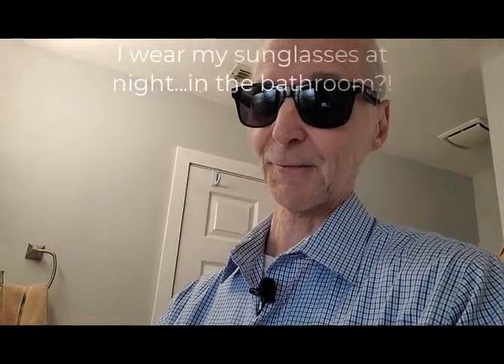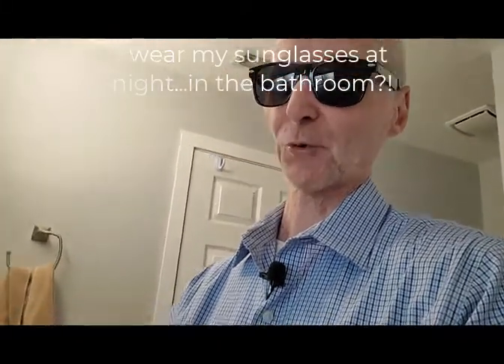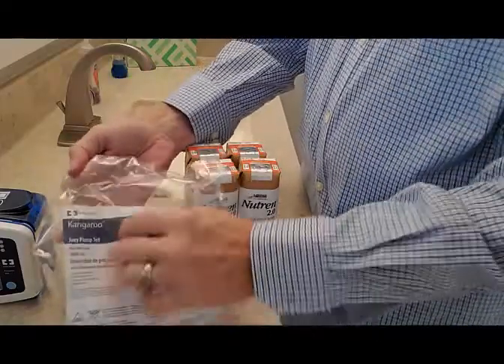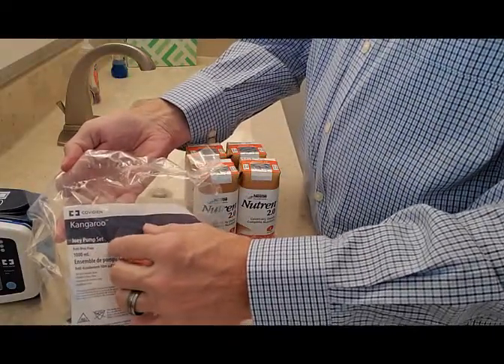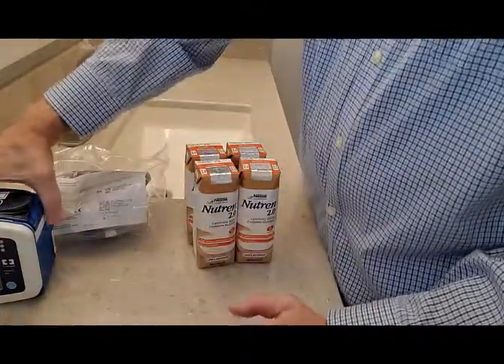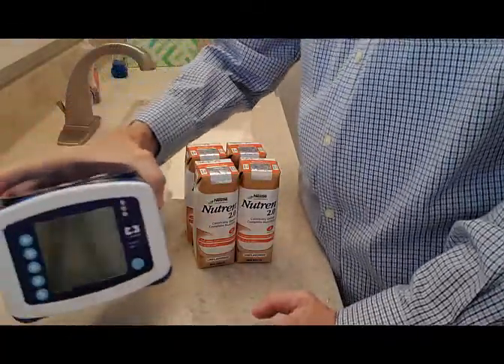I'm going to show you how easy it is to do enteral feeding with a pump. All you have to do is set it up and forget it. What I'm going to do now is show you how to set it up. First, you have your bag, 1,000 milliliters for me because I'm a hungry guy. And then you have the pump.